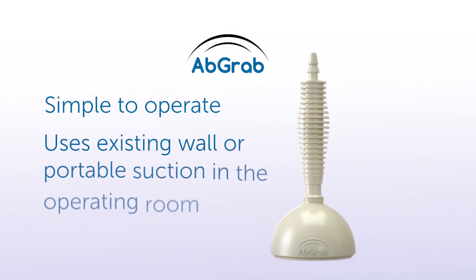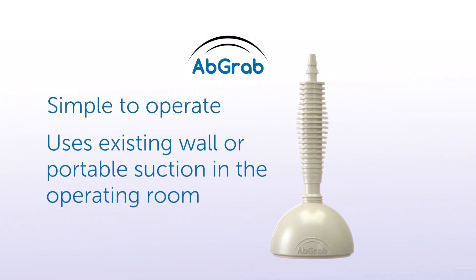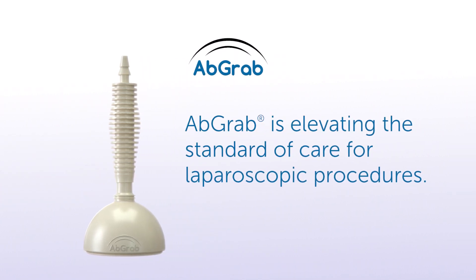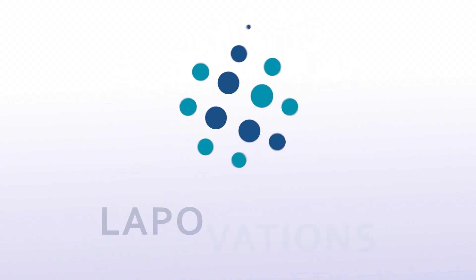AbGrab is simple to operate and uses existing wall or portable suction in the operating room. AbGrab is elevating the standard of care for laparoscopic procedures. Let's talk today about how it can benefit your practice.